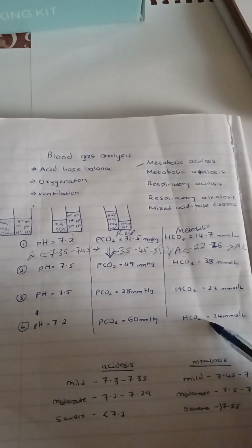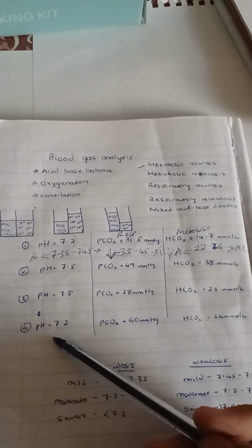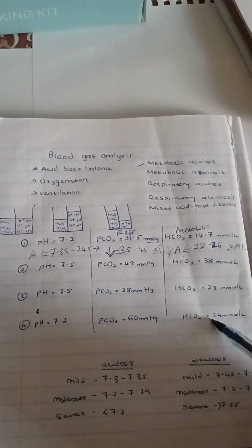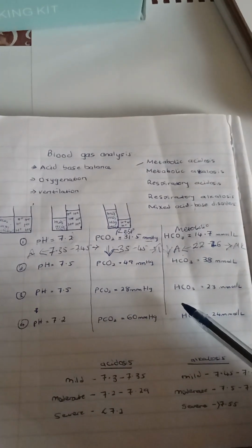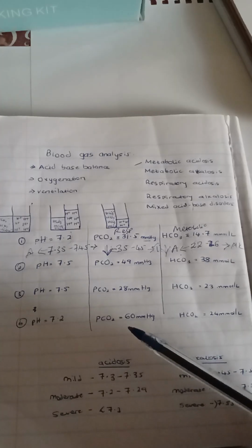Bicarb is 24, between 22 to 26, so that's normal. So it means this patient has respiratory acidosis. Bicarb can be normal, or it can also increase to compensate. So that's how we can interpret a BGA to be able to know the primary acid-base disorder.